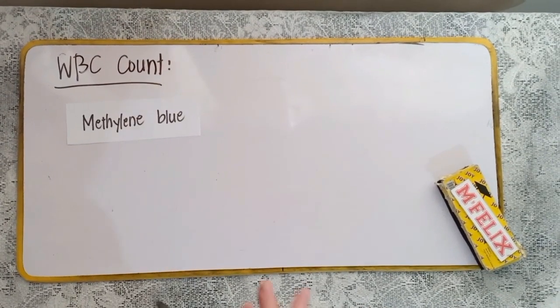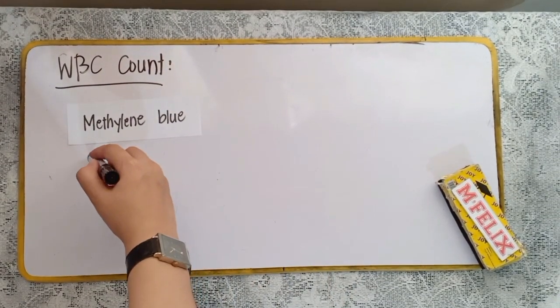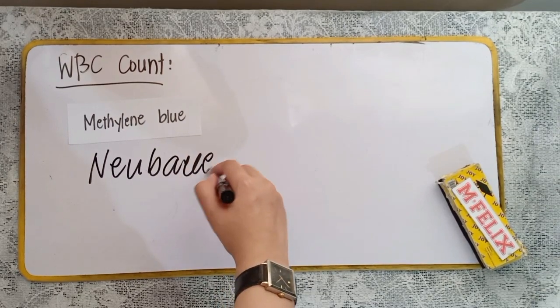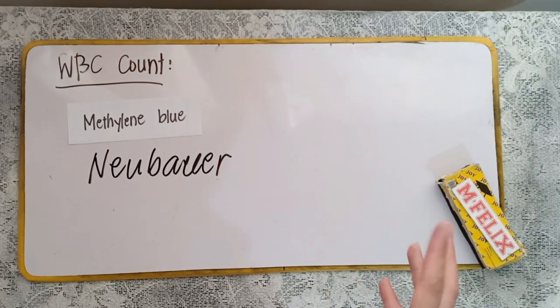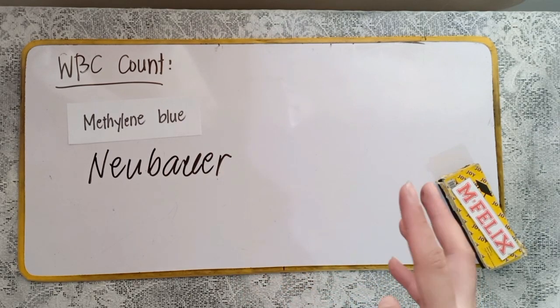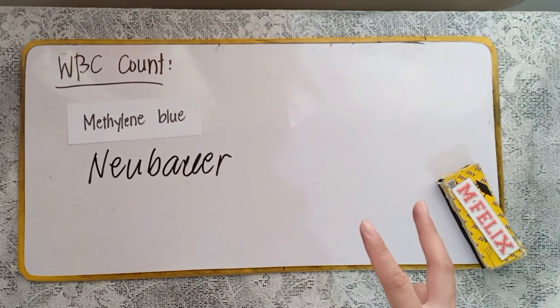Now, when performing WBC count, class, kung ano yung ginagawa natin sa hematology, parang ganun din lang sa CM. We make use of the improved Neubauer counting chamber, and ganun din yung ginagamit nating diluting fluids, and kung saan tayo magka-count, ganun din lang. As in the total cell count sa hematology, WBCs are counted in the 4 corner squares and the center square on both sides.